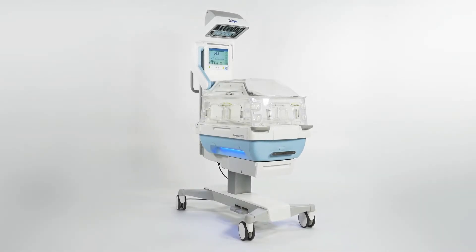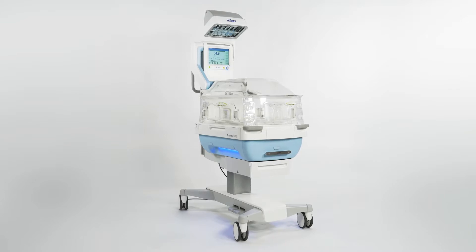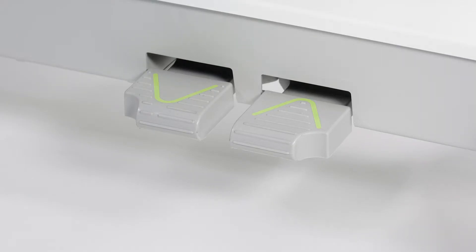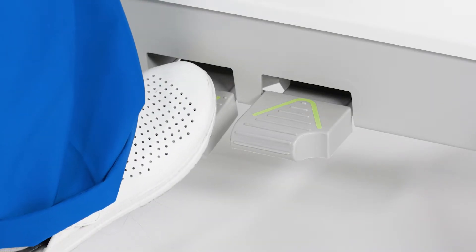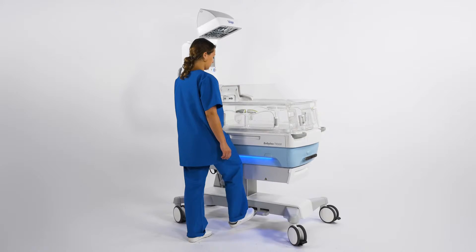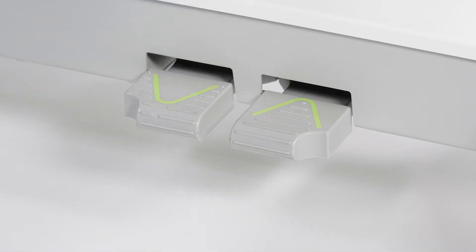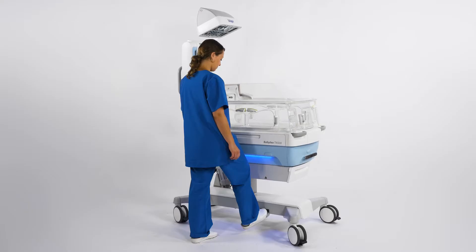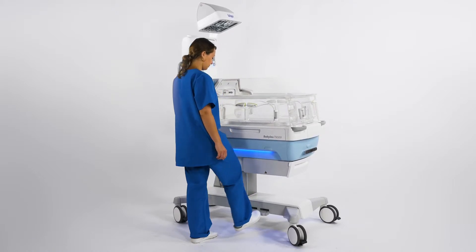Here we will demonstrate how to adjust the height, mattress tray and lock-unlock functions on the display. Let us begin with adjusting the height using the lifting column, which can be done from both sides of Baby Leo. To move Baby Leo down, simply press the left-hand foot pedal. And to move Baby Leo up, press the right-hand foot pedal. Make sure that you have enough room above the radiant warmer so as to avoid any collisions.